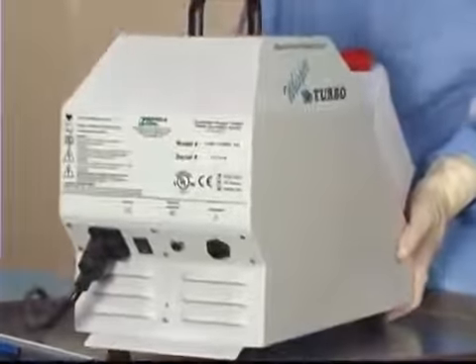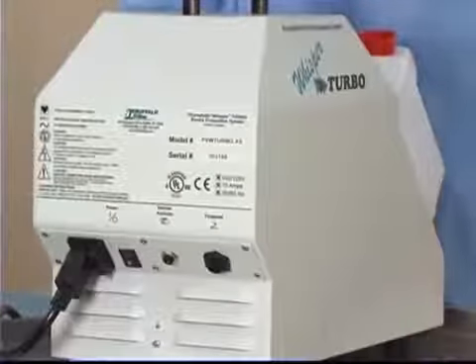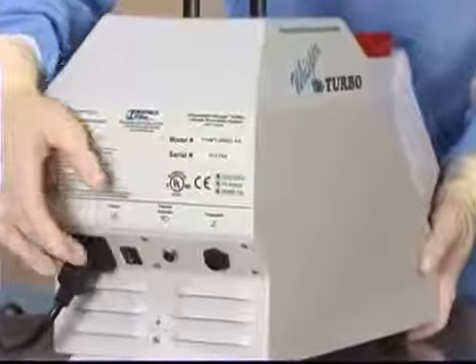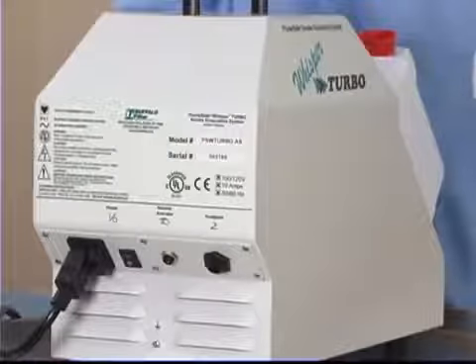The Whisper Turbo AutoSense is equipped with a main power switch located on the back of the unit and an on standby button on the front control panel. First, switch the main power supply on the back of the unit to the on position, indicated by the number 1.